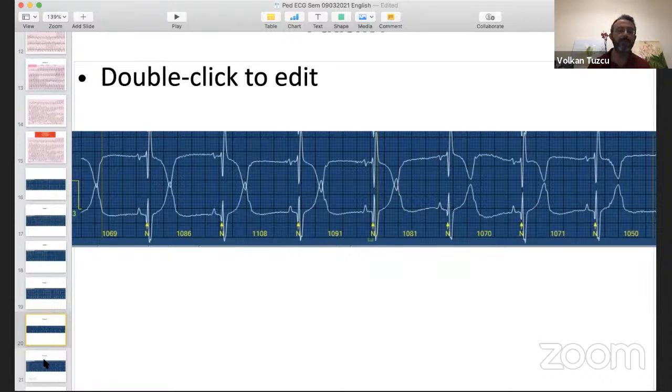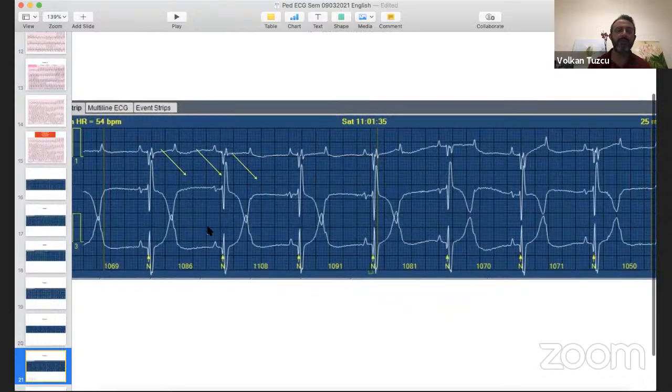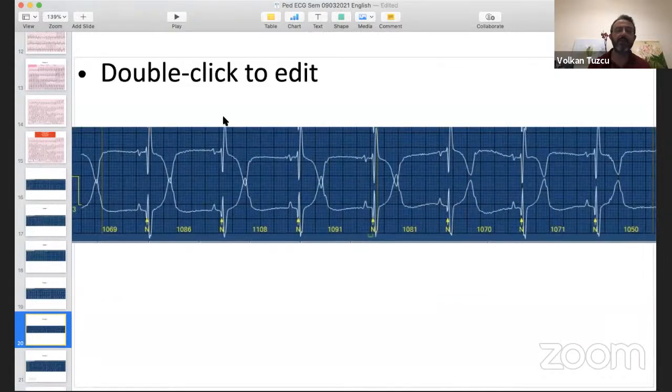So when we continue to look, I intentionally hid the third lead from you. This is cut, actually. This was a 3-lead Holter, so I cut the third lead. I wanted to make a comment, because this is what you may be seeing, just these 2 leads, or even 1 lead on the monitor, in the telemetry. This is why doing a 12-lead ECG, getting simultaneous different leads, is very important.